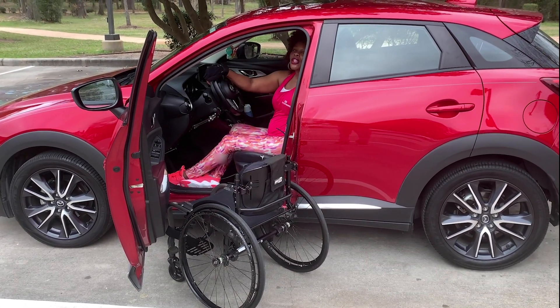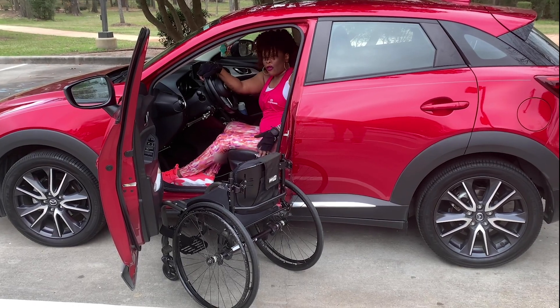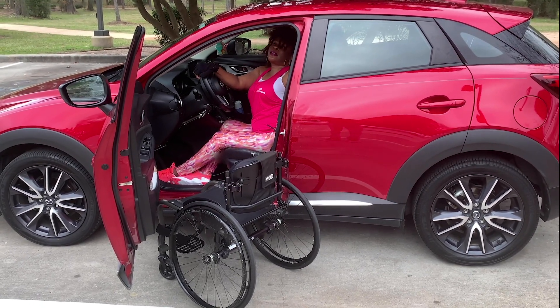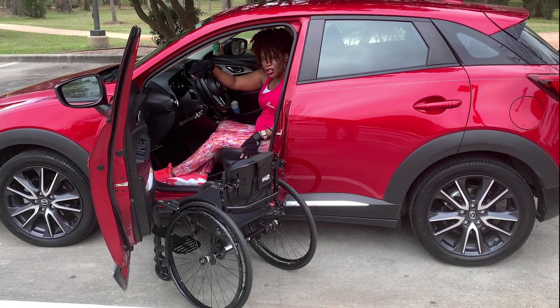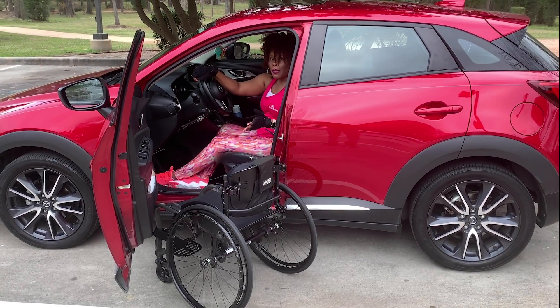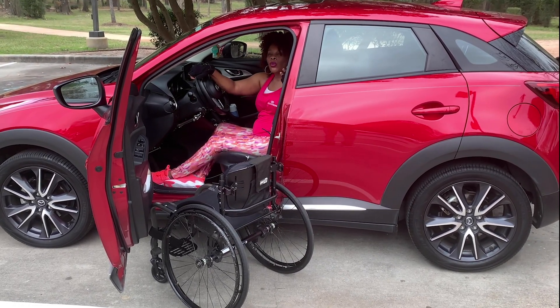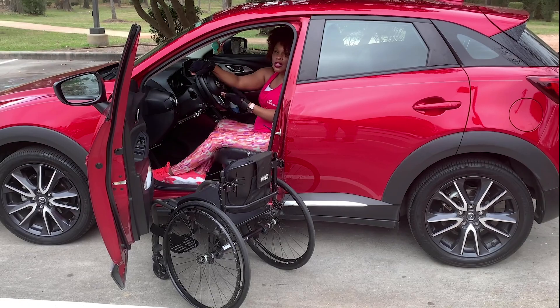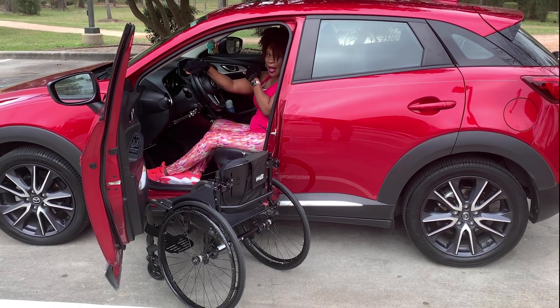Once I have my cushion in the car, the next thing I'm going to put in is my wheels. But before I do that, I'm going to put my seat back just a little bit, because once I take the wheels off my chair, the next step would be to put the actual base of my chair into the car. I want to make sure I have enough room between myself and the steering wheel to get the base of the chair in.